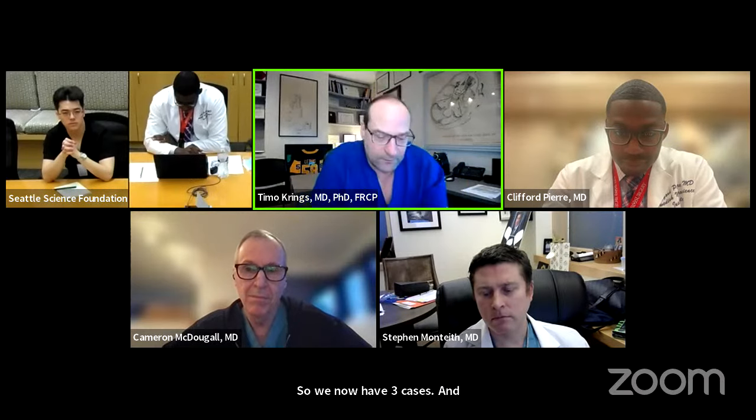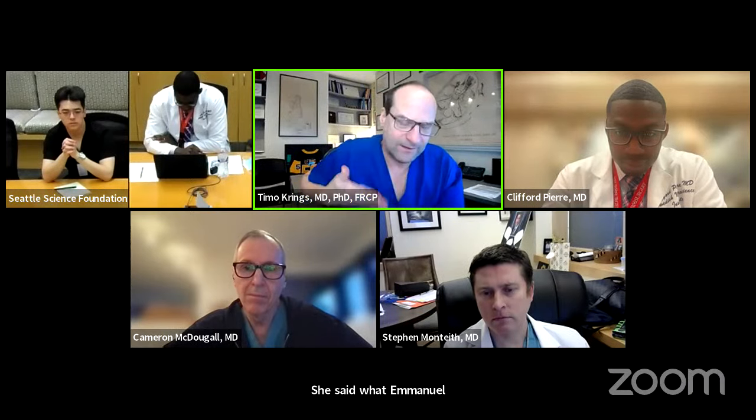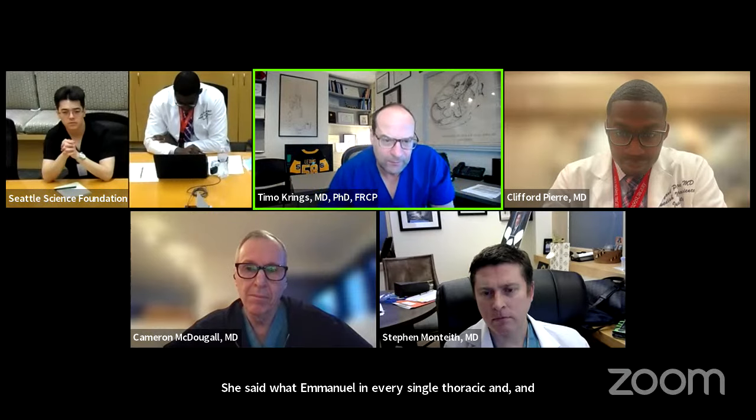And so when I discussed this with another previous fellow of ours, Stephanie Lenk, who worked with Emmanuel Houdart in Paris, she said what Emmanuel Houdart does in every single thoracic and upper lumbar spinal dural AV fistula is he does a vaso CT and floods the vessel with contrast. And with this, you see even the smallest cord supply. So that's something that we have not attempted here, but it does make sense.